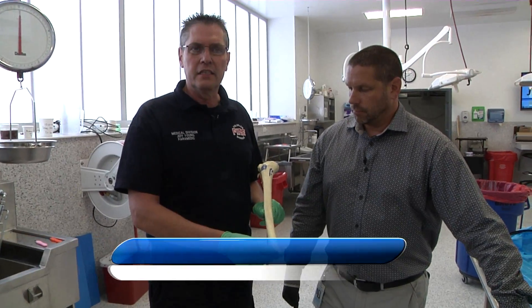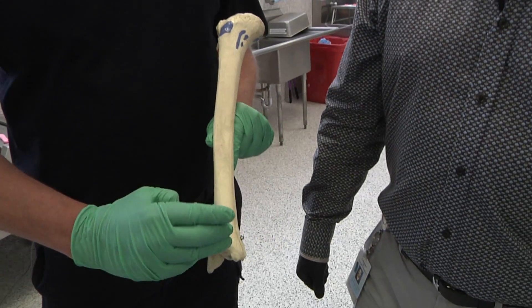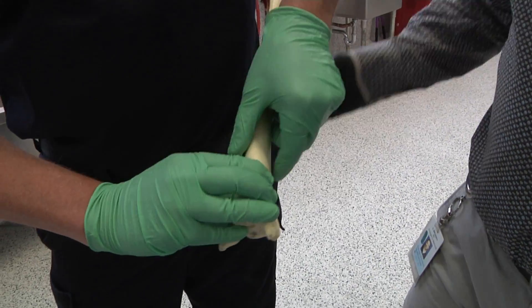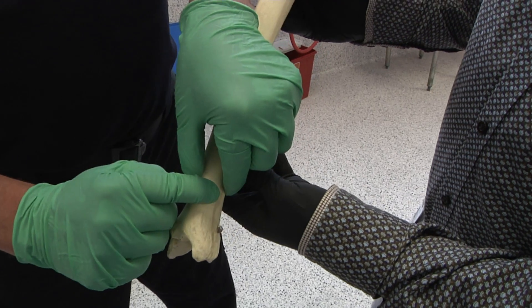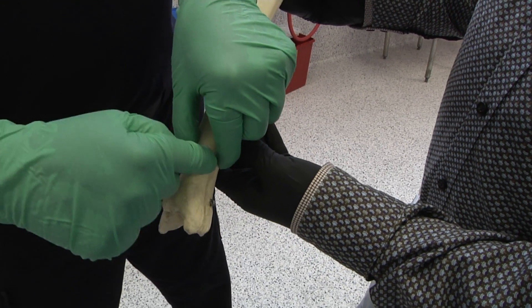Another alternative site is the distal tibia. On some thin people, this is very easy to identify. We find the medial malleolus and put our third finger on it. We've isolated the tibia, so we know exactly where the tibial bone is. You don't want to be off-center. Right below your finger, you've already identified the tibia, and that's our point of insertion — right in the flat part of the tibia.